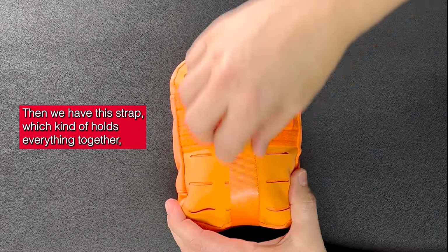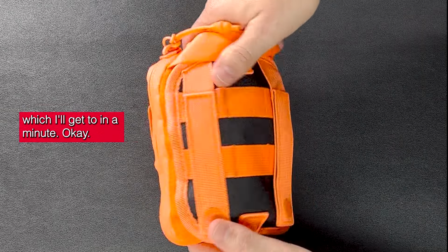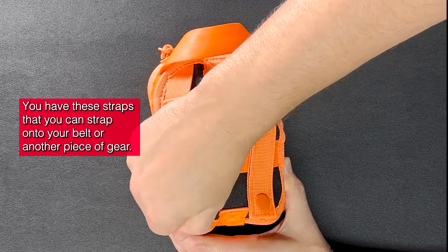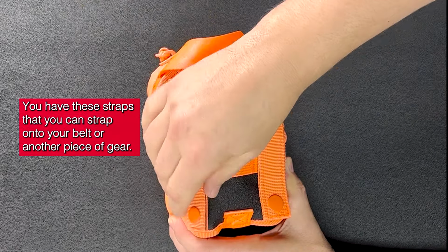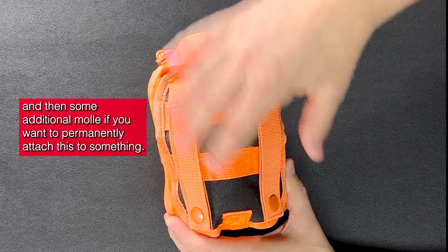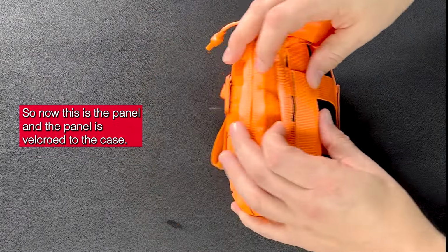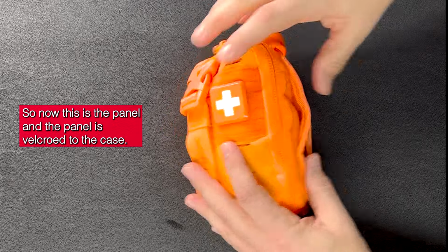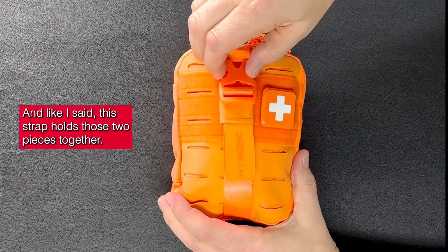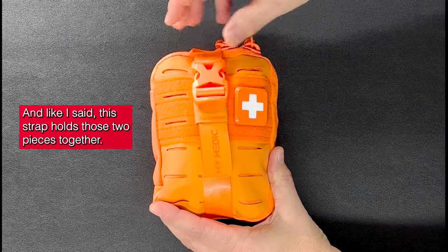On the back, and then we have this strap, which kind of holds everything together, which I'll get to in a minute, okay? Now on the back, kind of the same thing, right? You have these straps that you can strap onto your belt or another piece of gear, right? These quick release straps with these snaps, and then some additional MOLLE if you want to permanently attach this to something. Okay, so now this is the panel, and the panel is Velcroed to the case, okay? And like I said, this strap holds those two pieces together, right?